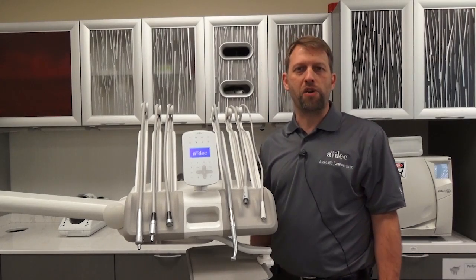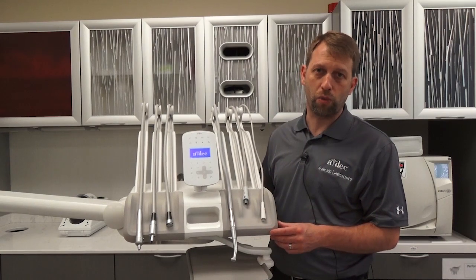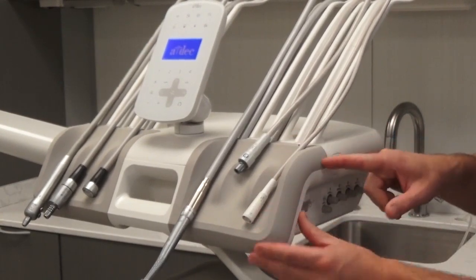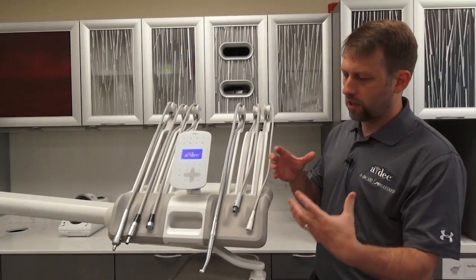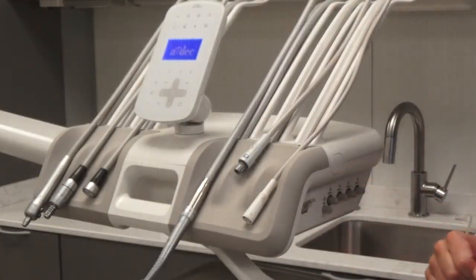Hi, my name is Thaddeus. I'm a technical trainer here at ADEC, and today I want to talk about the instrument pads on the 533 delivery system. Sometimes you can get a little bit of a gap between the delivery head and the pad right here along the seam, and if that's the case, they're sometimes difficult to get seated all the way. I'm just going to talk about how you'd fix that.